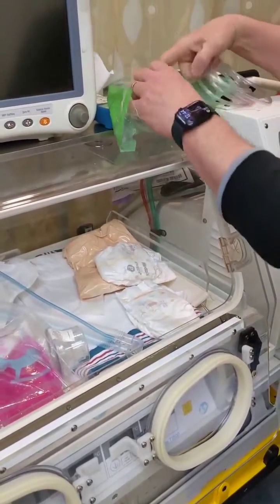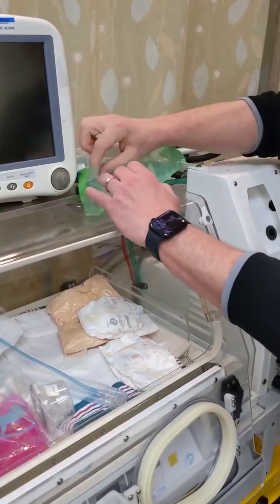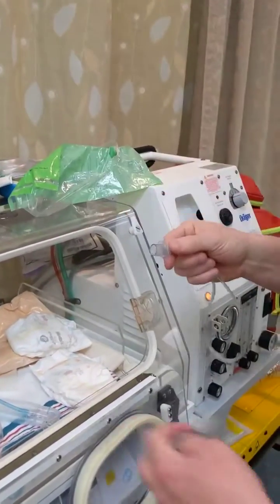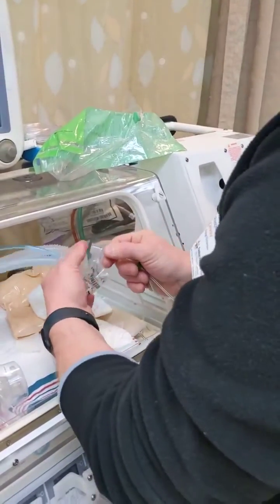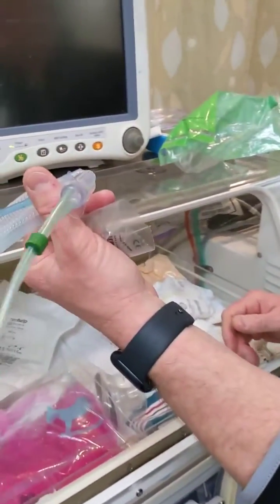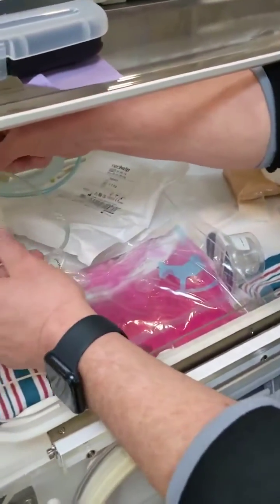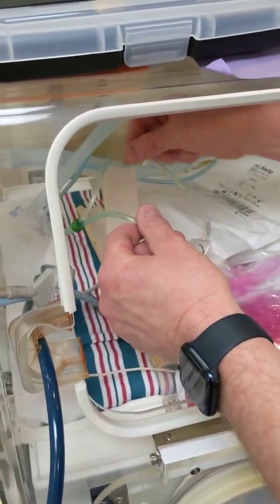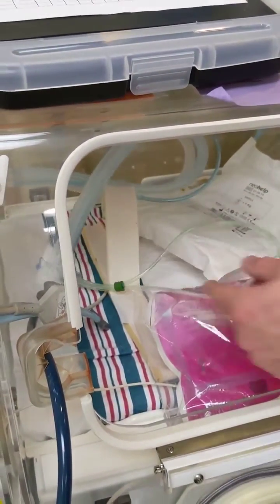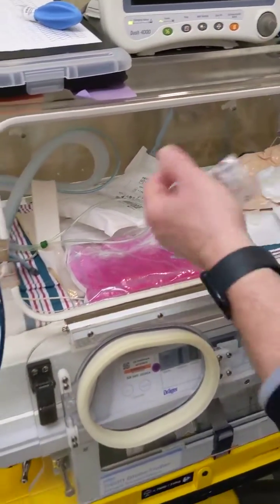The important thing to know is that the RAM cannula is designed to connect directly to this circuit right here. So I can connect him up right there and place my baby on that 7 of CPAP. Package him up, make sure you're set, and come on home back to resting.